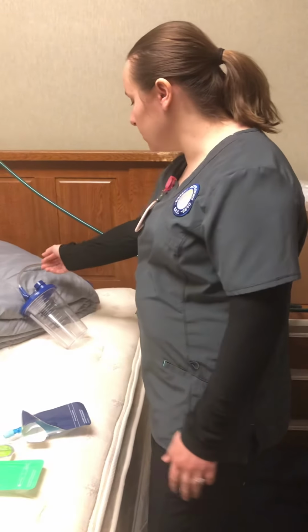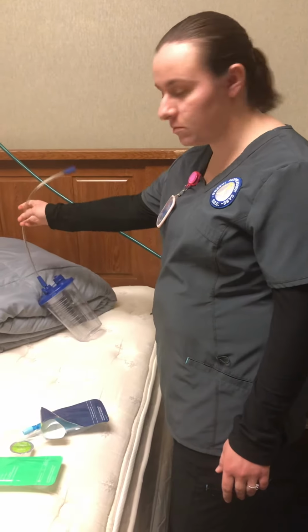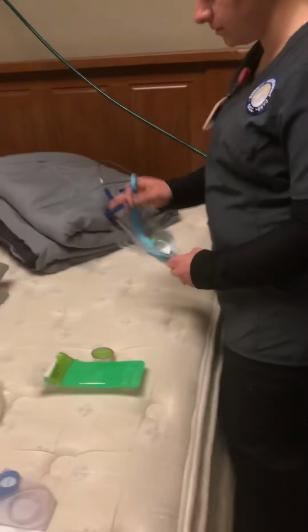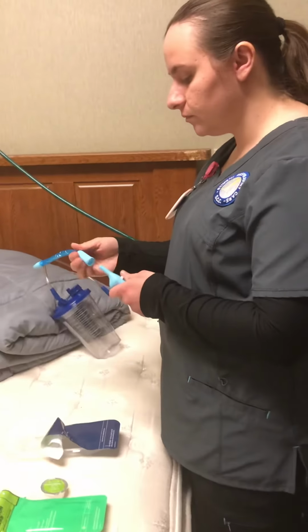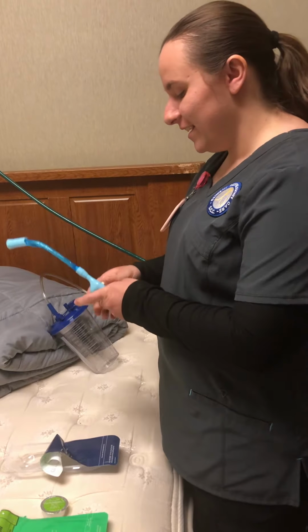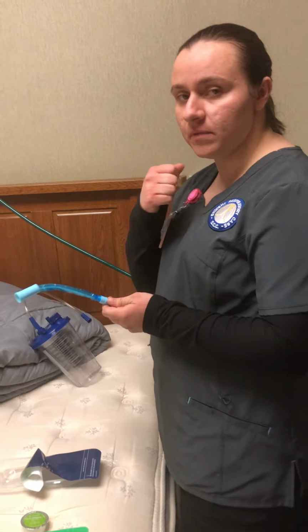So the first thing you're going to do is go ahead and connect your suction canister to your suction meter. So you would have a -100, -120 when you're doing your suctioning. You're going to get your Yankauer ready. So you're going to connect it to this side. And then what you're going to do is suction out any excess stuff before you do the cleaning.